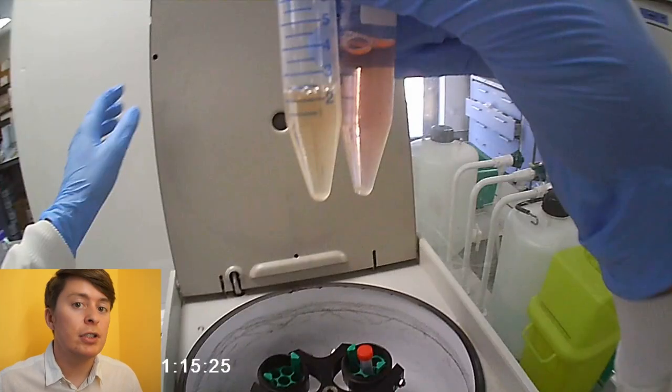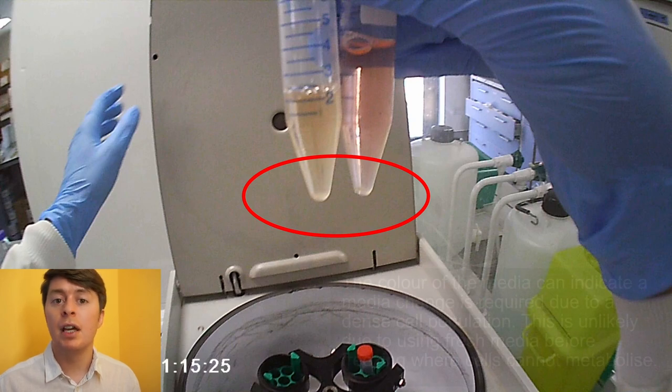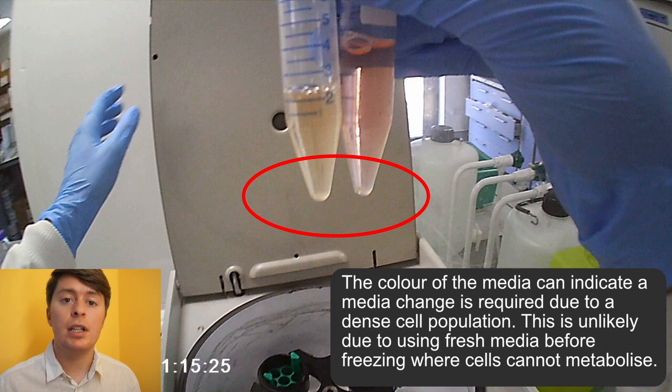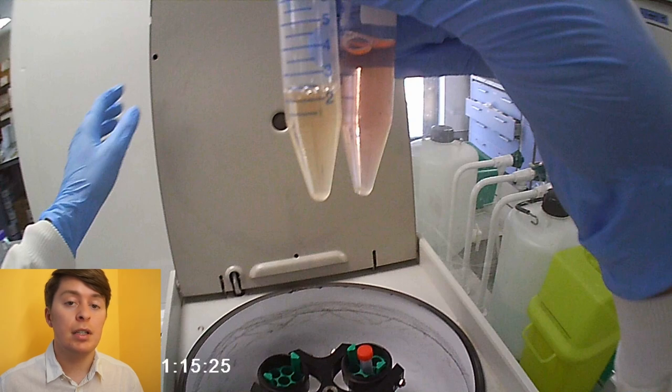Here I have the two skinny Falcon tubes. You might be able to just about make out the small pellet at the bottom. I promise you it's there, it's just very difficult to capture on camera. The difference in media color happens to just be the aging of the media when I initially froze down my cells. That's no indication of the quality of the cells in that pellet, nor that there's anything wrong at this stage. Media over time can age and change color, and that's nothing really to be concerned about at all. But obviously, if you can, use fresh media and try to use it within the allotted time frame recommended by the manufacturer.